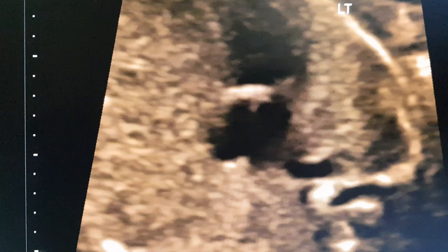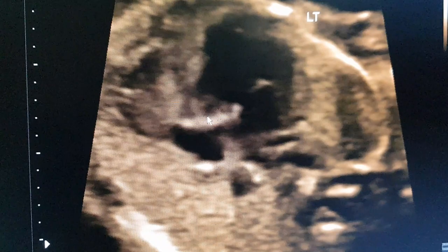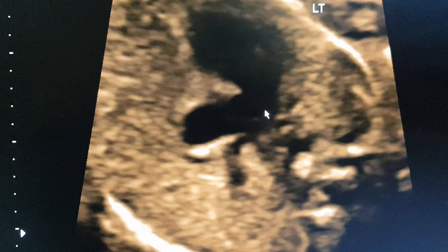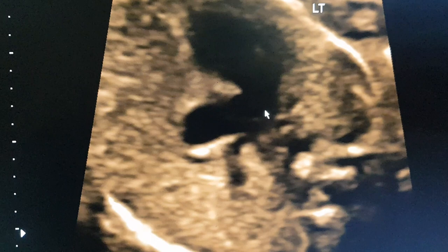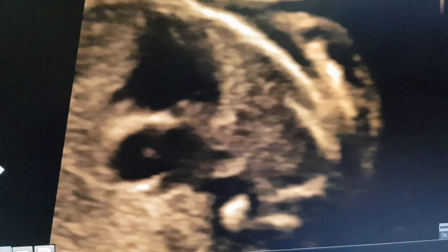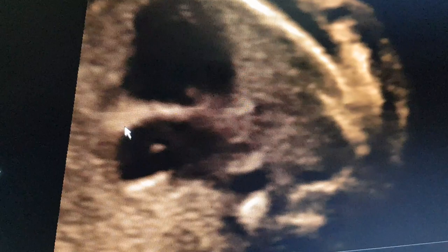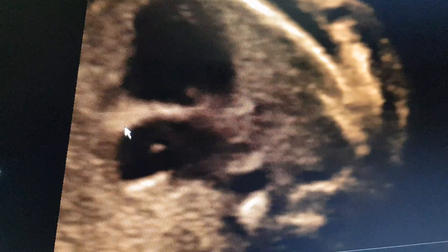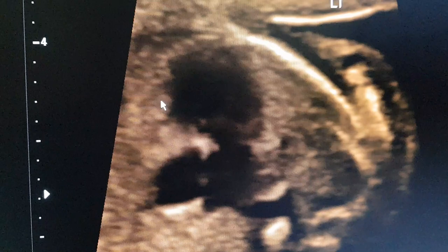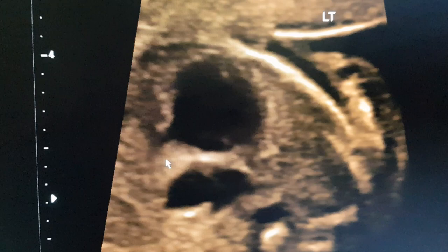We try to look at the valves in more detail. That is the mitral valve opening and closing — that is the septal leaflet of the mitral valve. The tricuspid valve just moves anteriorly and posteriorly with cardiac movement but there is no opening or closing of the tricuspid valve. This is the image frozen during opening of the mitral valve — widely open — and here the mitral valve is closed and well coaptated. The mitral valve apparatus looks normal with normal Doppler. The tricuspid valve is on the right side and we have a very small collapsed right ventricle, probably with no lumen. So the possibility of double inlet single ventricle has to be entertained.